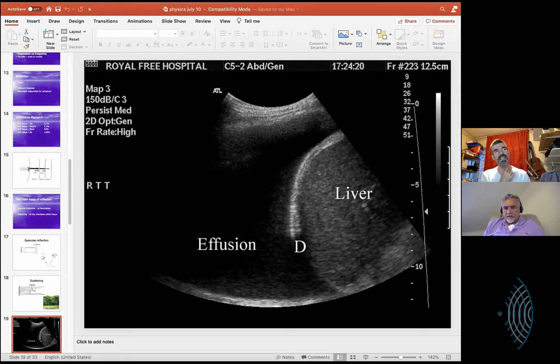And even in this area here, because there is some noise within there, you can see a bit of noise here. Yes. But when you turn it up in a cyst, you'll get used to it, and if you always do it whenever you see fluid, always turn up the gain to where it gets uncomfortable, you'll see that it turns up in a very placid, very bland way. As soon as you get something that's got a little bit more texture to it, you will start to very easily pick up that it just doesn't look right.